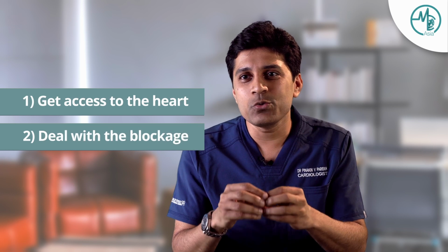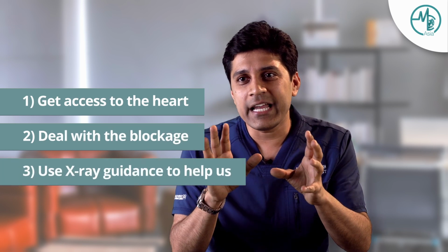And it involves the passage of tubes and wires and balloons and stents through the access point under X-ray guidance in an operating theatre. There are some additional tools that we use these days. We even have special cameras that can go inside the heart's blood vessel, to look at the structure of the blockage and determine the sizing of the stents that are required. So very technical, keeping it very simple: get access to the heart, use some devices to deal with the blockage, and use X-ray guidance to help us.